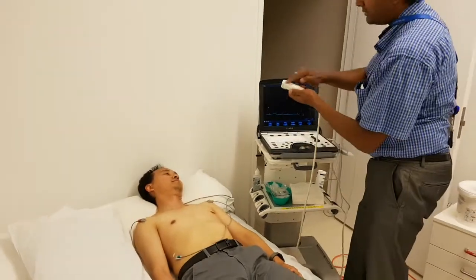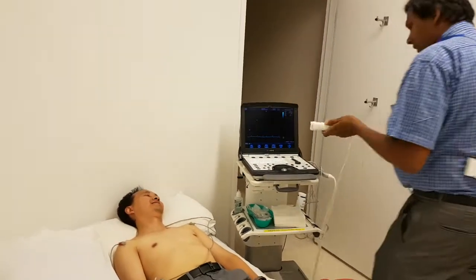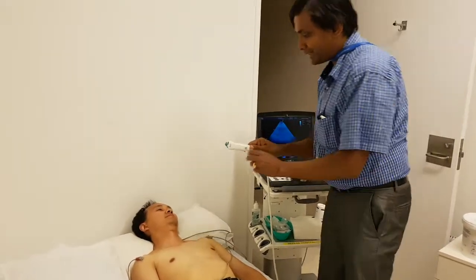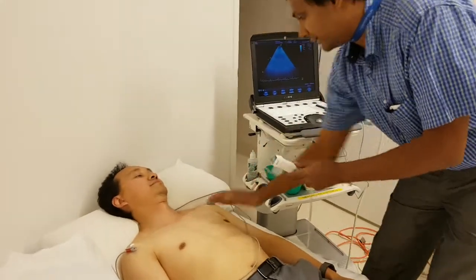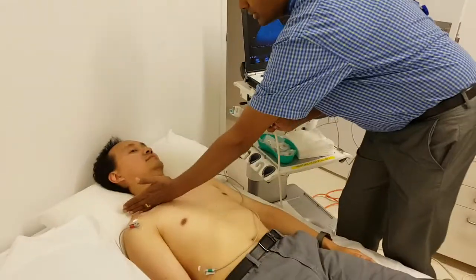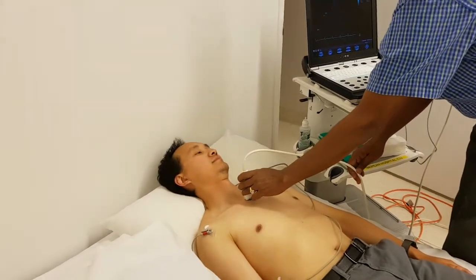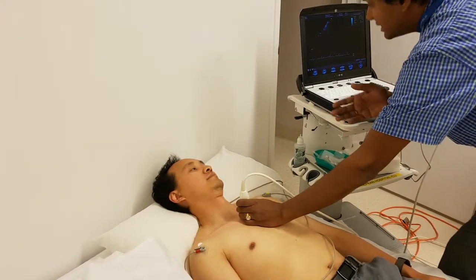For the parasternal long axis view, I'll apply gel and direct the probe marker along a line from the right mid-clavicle toward the left hip, as I expect the heart to be in that region. I keep it slightly high up and map the heart — I don't know exactly where it is, so I start mapping it.